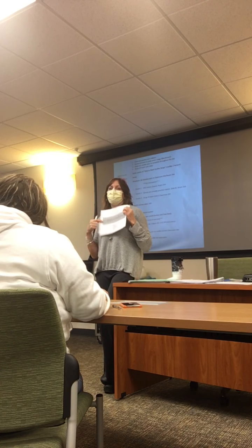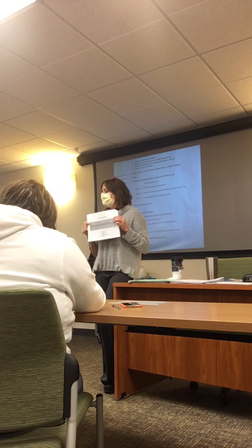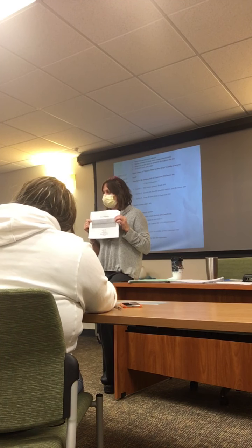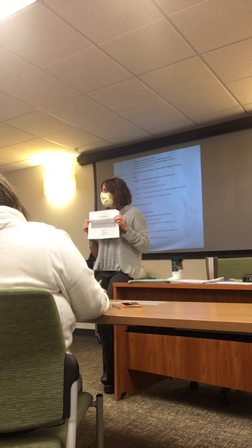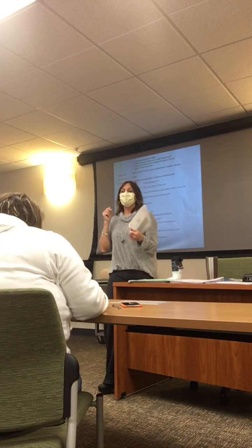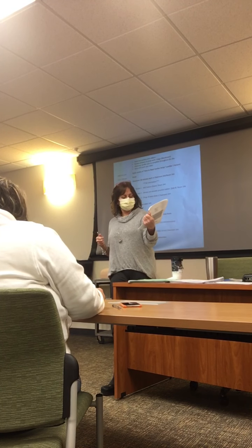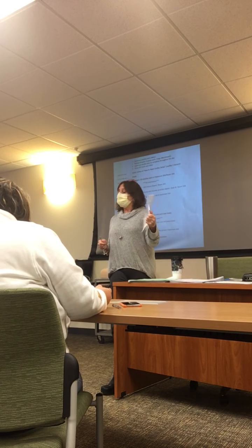So rate. I have 6-second strips. So I count the number of R waves in the 6-second strip. 12, 120. Because we count the number of R waves and multiply by 10, and that gives me the heart rate. So what'd you say?